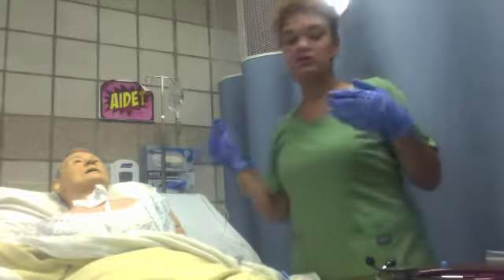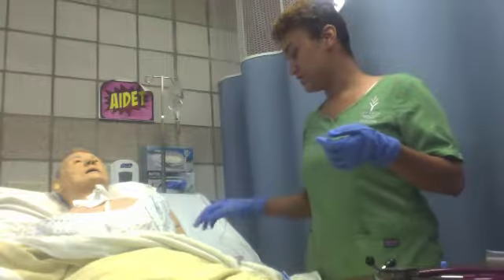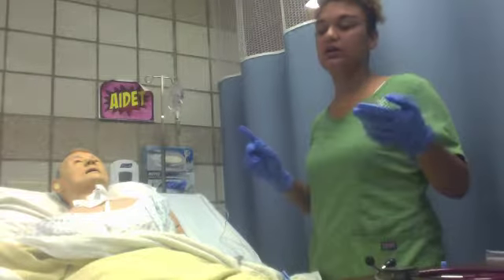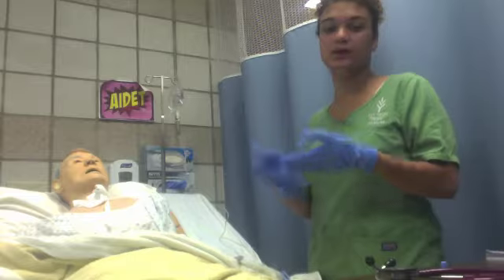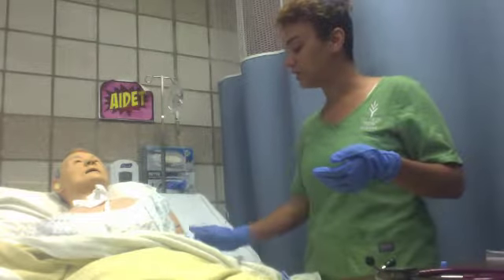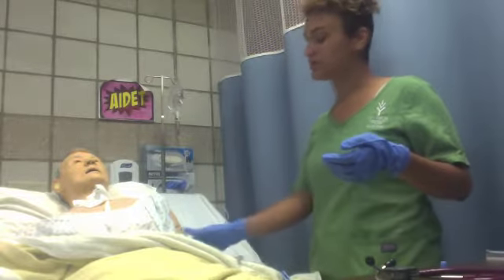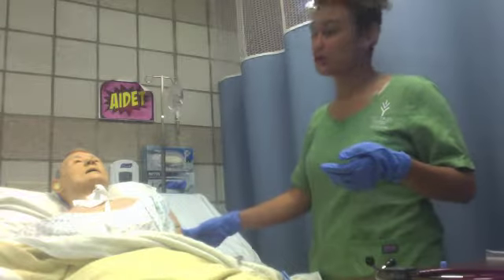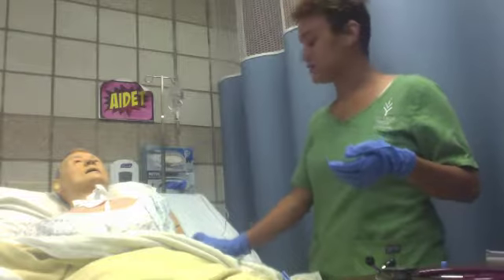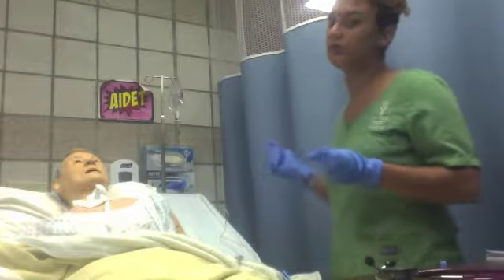Okay, so now I'm going to move on to the site. For the site, I'm looking for any infiltration, infection, phlebitis, looking for any blood or any pain on palpation. When I palpate, I'm palpating for induration, making sure there's no pain around, that nothing's coming up through the skin. Through the dressing, I'm checking the patency of the dressing, the date, the expiration of the dressing, when it was last done, checking all of that with the computer to make sure that these are being documented appropriately.